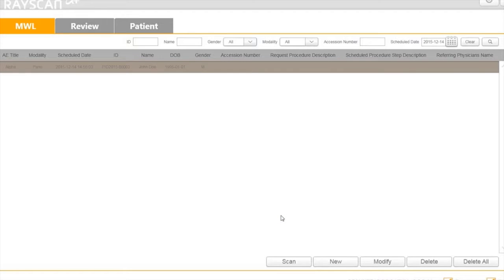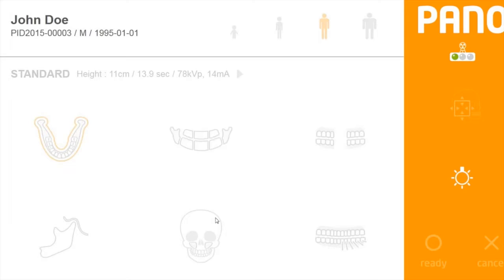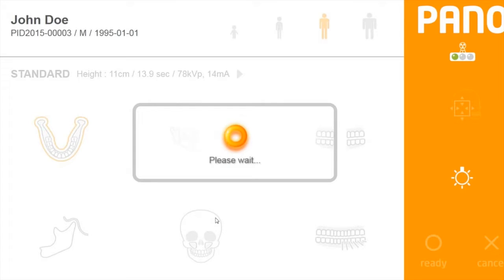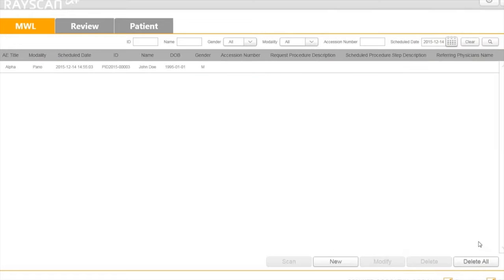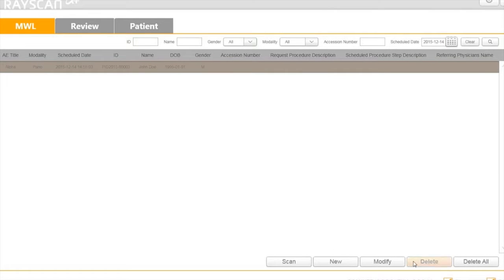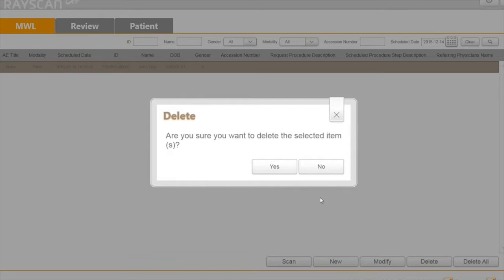As soon as your patient comes in, you can go right into the acquisition interface. You can use Delete or Delete All for more than one patient.